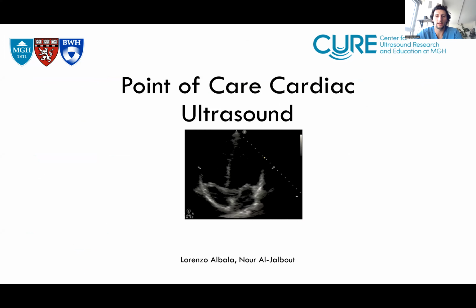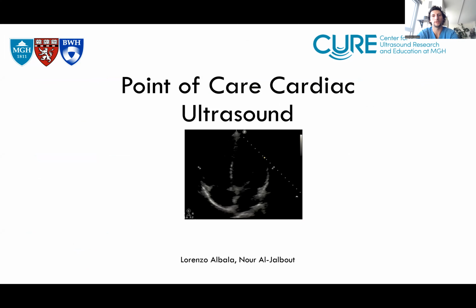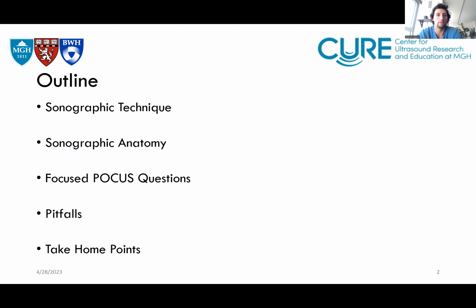I am going to be talking about cardiac ultrasound today in the final lecture of our point of care ultrasound fundamentals course for emergency medicine providers. Thank you to Dr. Noor Al-Jaboud for providing this lecture for us, and I'm excited to get into it with you. So first, we're going to talk about the sonographic technique.